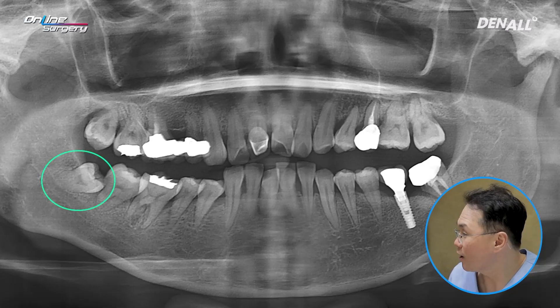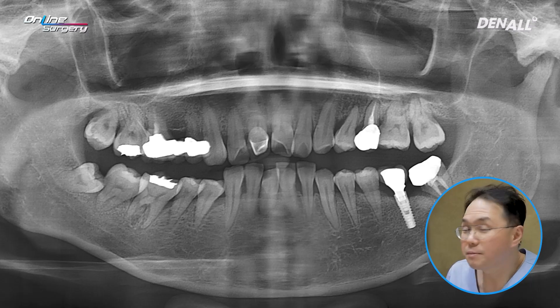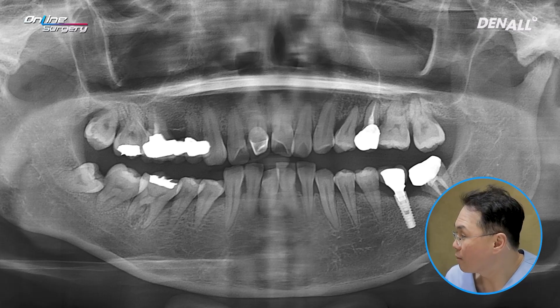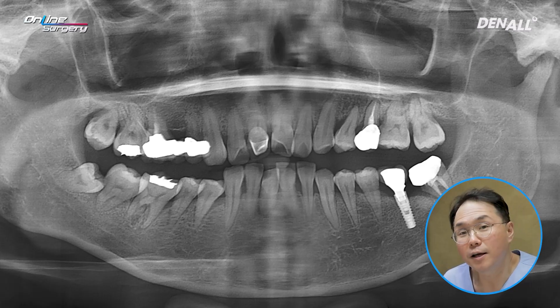There's a horizontally impacted No. 48. No. 4, 5, 6, and 7 are visible. The periodontal condition is not very favorable. Four teeth were to be extracted, and three implants were planned.